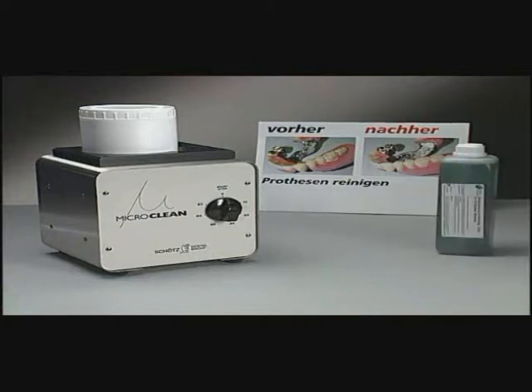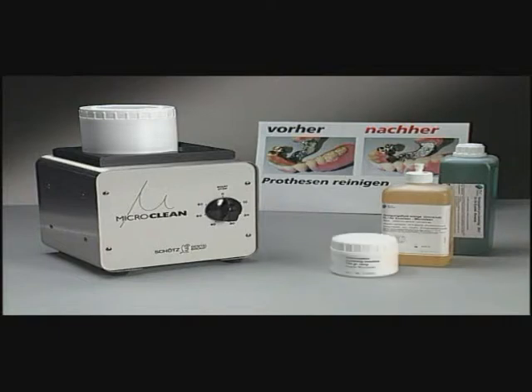Weill Dental, a subsidiary of Schutz Dental, is located near Oberurzel, Germany, where this magazine is compiled. Their chief technician presents MicroClean, a cleaning unit for dentures.